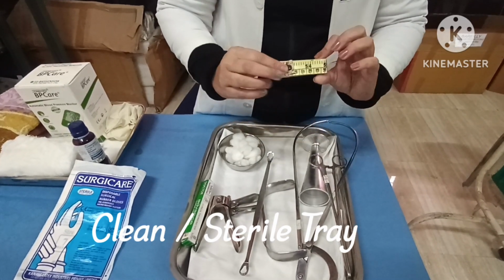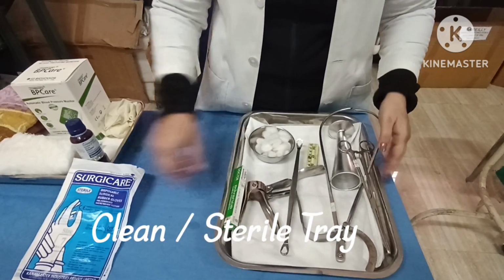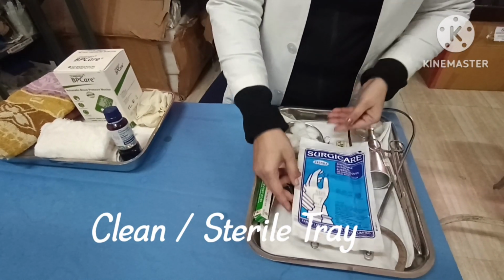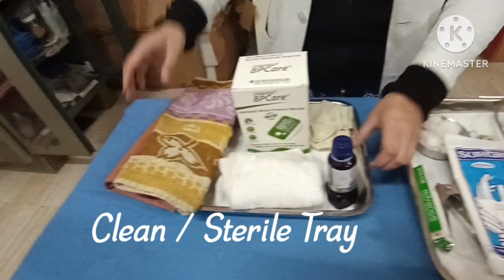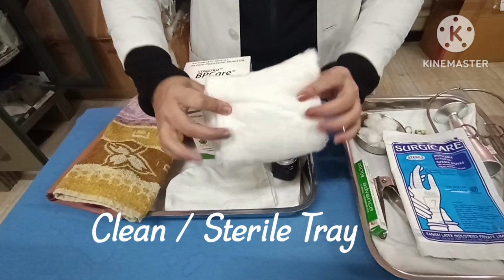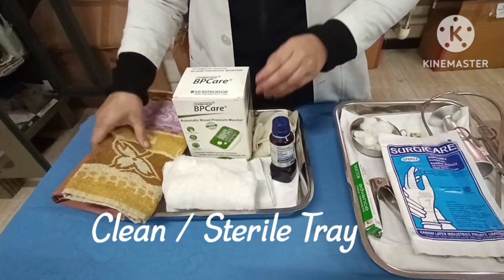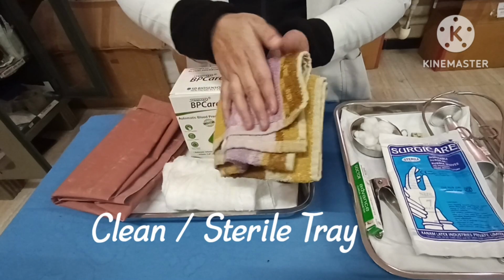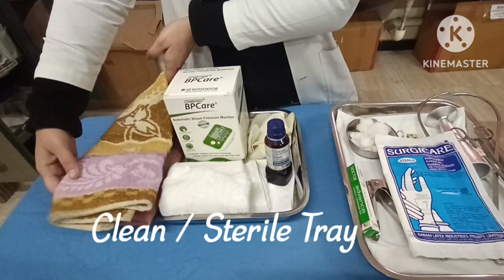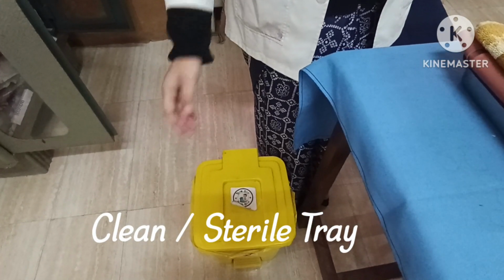inch tape, a bowl with cotton swabs, sterile gloves, a clean tray containing betadine solution, perineal pad, BP apparatus with stethoscope, a drape sheet with Macintosh, and a yellow bin to collect anatomical waste.